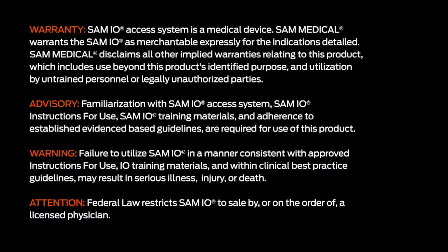As with all modern medical devices, the SAM-IO access system meets rigid safety standards, governmental mandates, and the demanding expectations of clinicians worldwide. The SAM-IO access system was developed with attention to the latest, presented, and published scientific evidence, as well as guidance from today's leading experts in the fields of emergency medicine, trauma, orthopedic surgery, critical and combat care, as well as pre-hospital emergency medicine. The SAM-IO access system's warranty, advisory, and warnings should be introduced as a component of this training program.